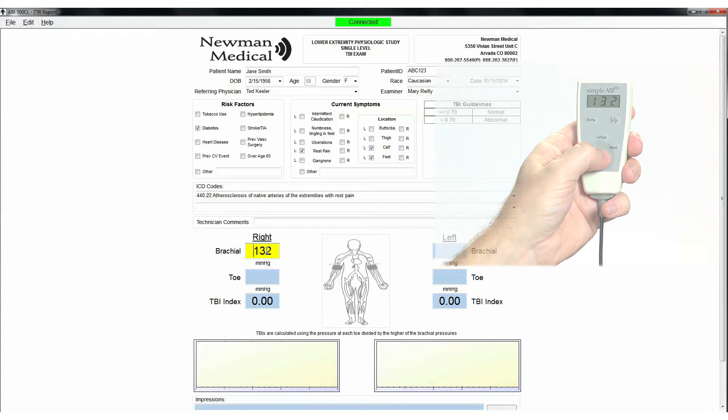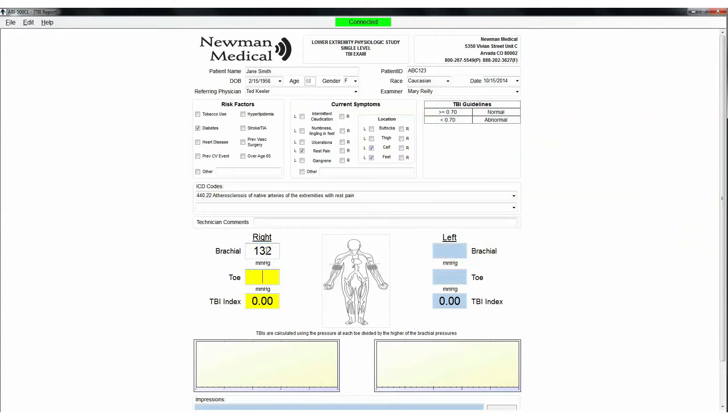When satisfied, press Next on the remote and the system will move to the right toe. While listening to the beeps from the PPG probe, press and release the Inflate button on the remote. It will then automatically begin to deflate. Press the Pressure button when the beep returns and the pressure will be stored in the right toe field.